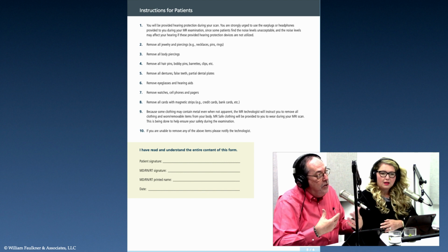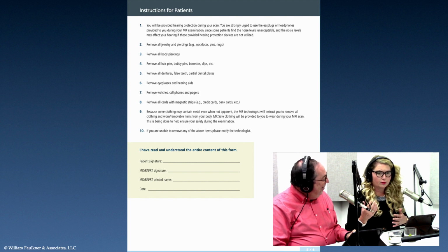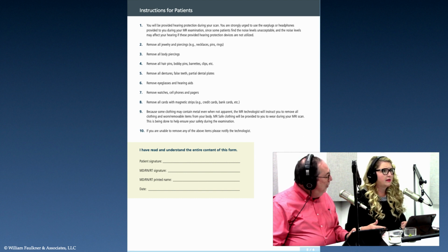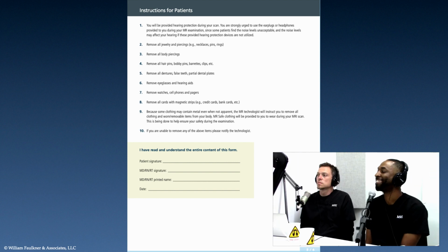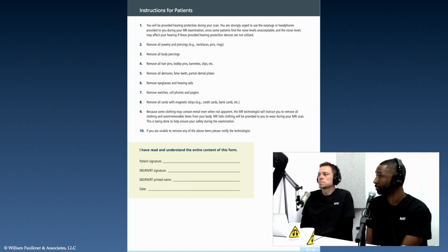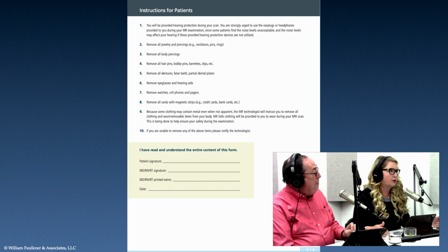It should. But then you just refer back to the FDA and the IEC, which, if you don't know, is the International Electrotechnical Commission. They both say that A-weighted root mean square (RMS) systems capable of exceeding 99 decibels must provide appropriate hearing protection. I'm not going to get into physics like he did earlier, but EPI diffusion falls around 110. And we're reaching 130 sometimes, right? Well, close. Could be close. Painful acoustic trauma is at 140, and all clinical vendors are limited to that.